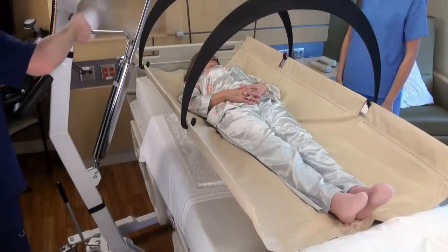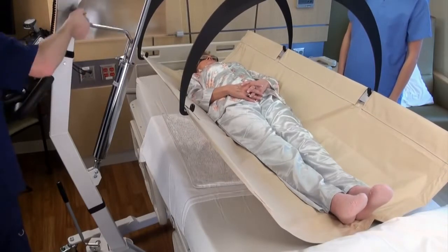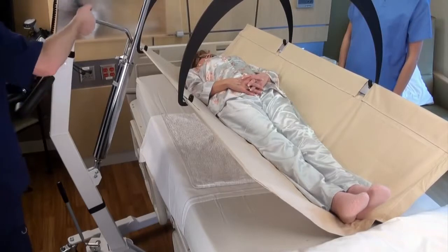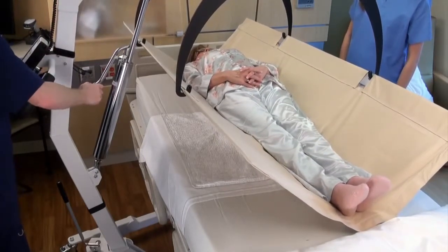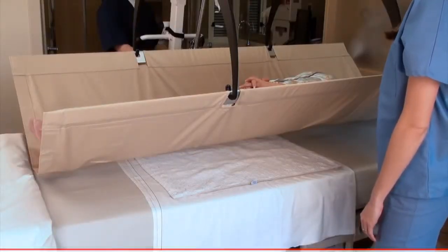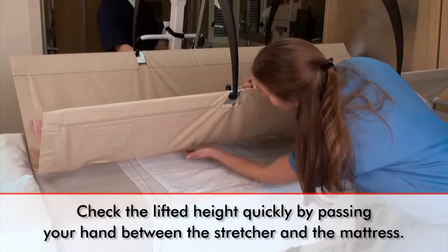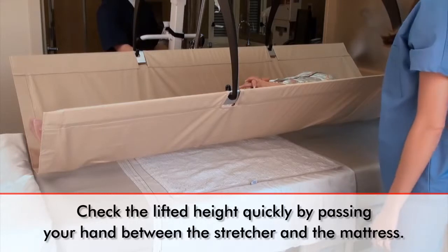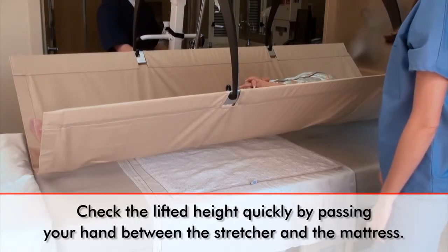Monitor the display of the indicator as the patient is being raised and continue pumping the handle until the patient is about an inch or so above the mattress. Make sure that no part of the patient or the stretcher is touching any part of the bed or mattress for an accurate reading. It is good practice for the medical professional to quickly check the distance of the lifted patient from the bed by passing their hand freely between the stretcher and the mattress. This is all the distance that is needed between the lifted patient and the bed to receive an accurate weight.